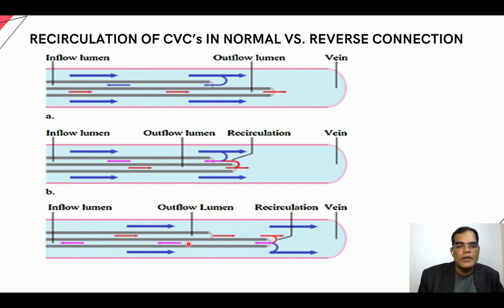portion where the blood will be sucking into the extracorporeal system. Meaning, if you reverse it, the larger portion of the blood will be again passing through the place where the blood is taken for dialysis. So the recirculation amount will be extremely high. I'll explain this in detail in the next slide.